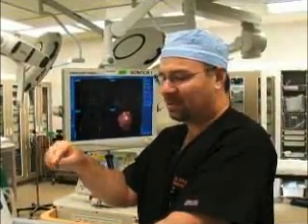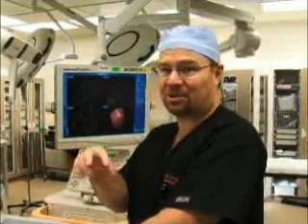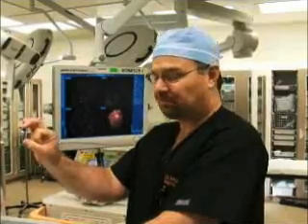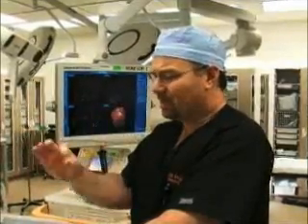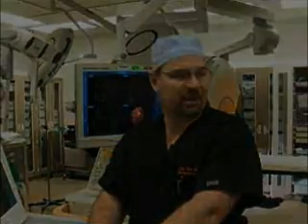We put a catheter in the clot and evacuate it, either using the microscope or, more recently and more novel, using an endoscope — so that we can go through no more than the size of a nickel, get into the clot, and evacuate it. This is very important in terms of our being able to precisely target that clot in the brain.